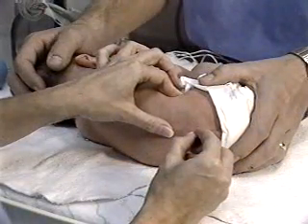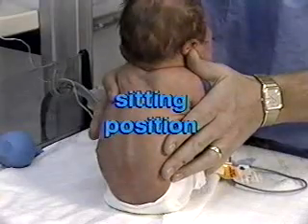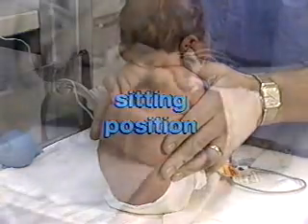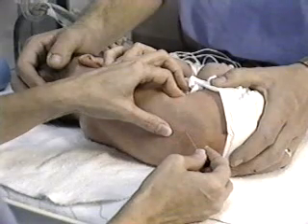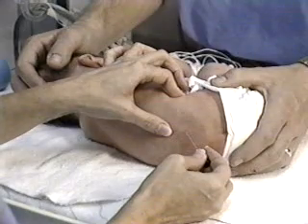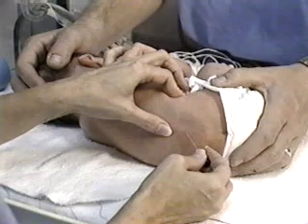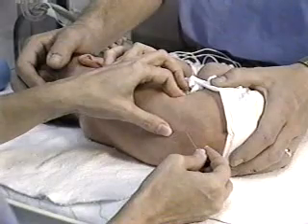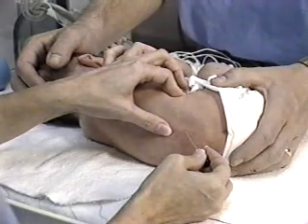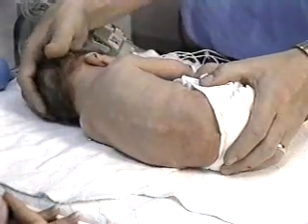There are 2 positions used for the lumbar puncture procedure: the lateral decubitus position and the sitting position. In the lateral decubitus position, it is important to identify the practitioner's dominant hand, left or right, and to position the neonate's head on the opposite side of the practitioner's dominant hand. Looking at this more closely, if the practitioner is right-handed, as demonstrated, position the baby's head to the left. Since the needle must be inserted so that the tip of the needle is directed toward the infant's head, this allows easy access to the intervertebral space.